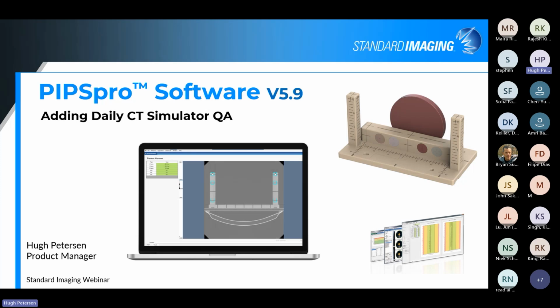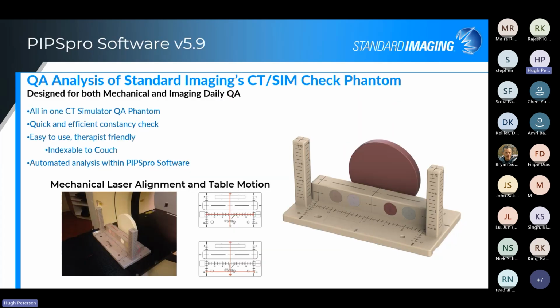So that's one of the components, but the bigger feature set we've added to PIPSpro for version 5.9 is the advent of the daily CT simulator QA. So we'll talk about that a little bit today. So today I just want to talk about, again, our new PIPSpro 5.9.